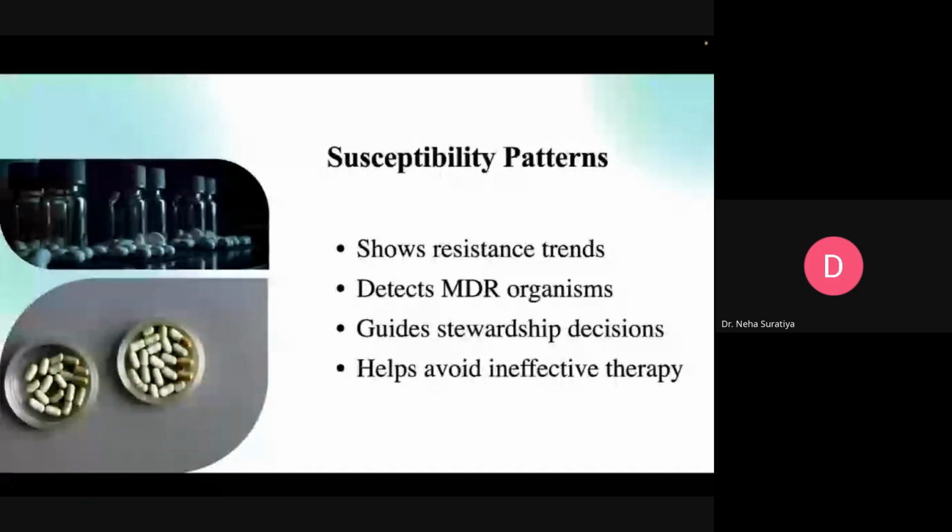But yes, susceptibility pattern gives you the idea about MDR. It is guiding stewardship decisions, and it helps us to avoid ineffective therapy. Of course, if you are identifying it correctly, ineffective therapy you can eliminate. So this is the pattern it is helping to understand.